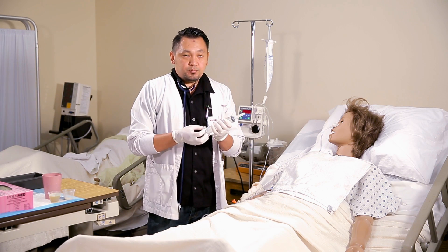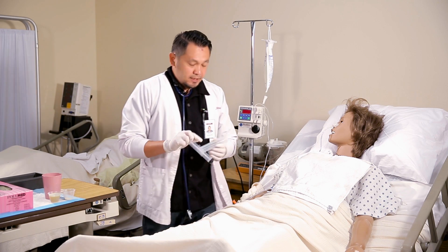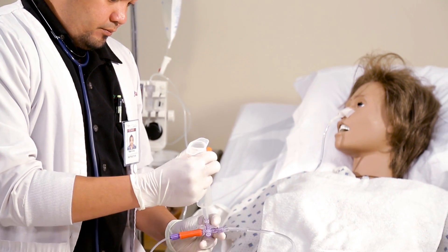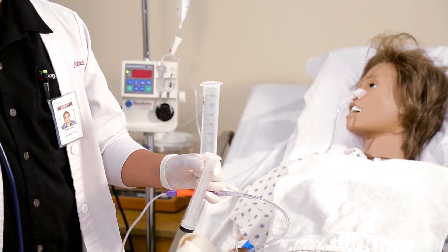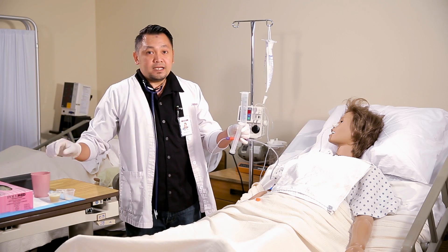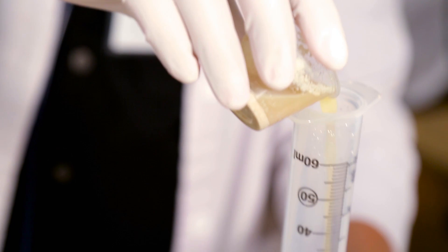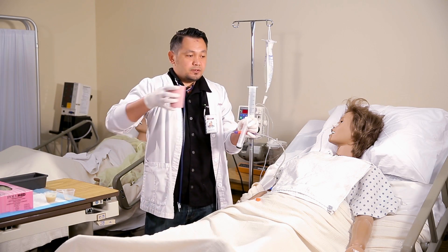Take the syringe and pull out the plunger. Attach it to our Lopez valve. Do an initial flushing of 15 mLs of water. After medication administration, follow another flush of 15 mLs of water.